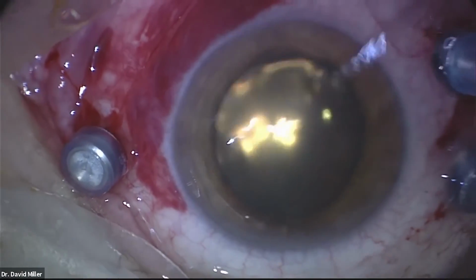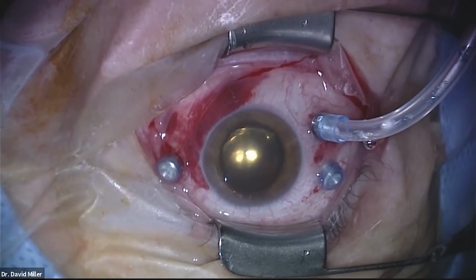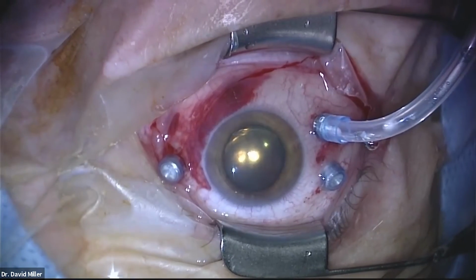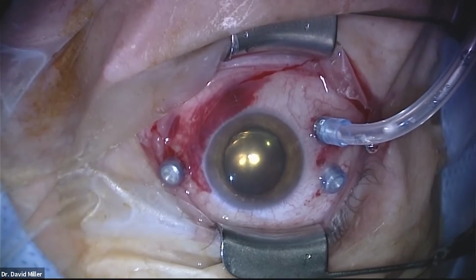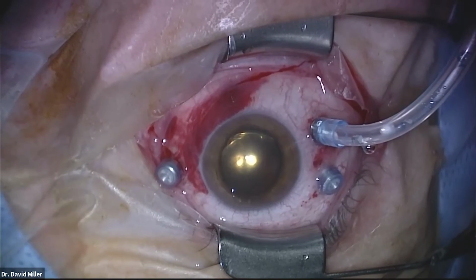And we'll wait for the gas to come over. And I think we're in pretty good shape. Looking at the characteristics of the detachment, the size of the breaks, the amount of what's going on here, I think our chance of success in this case is also very high. I think, John, you're going to do very well.